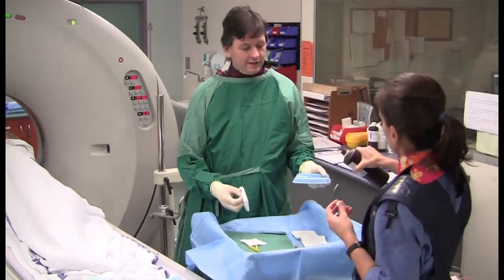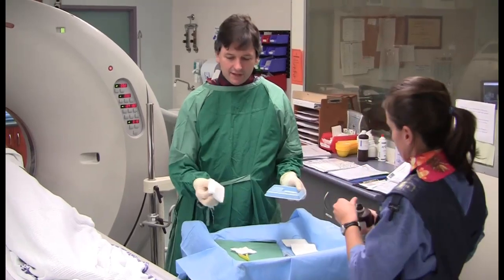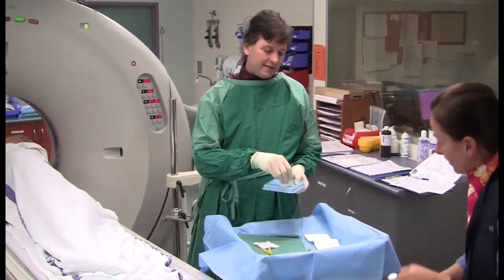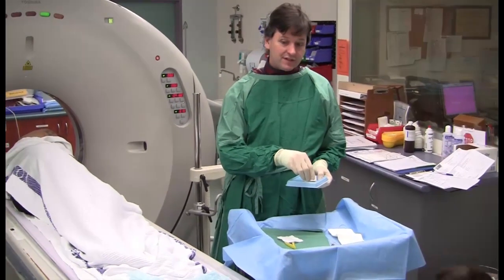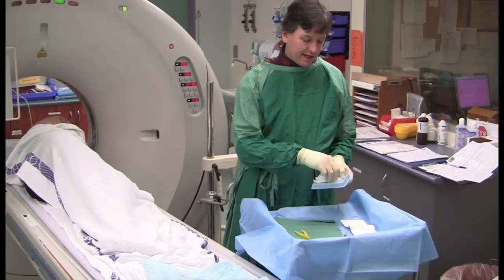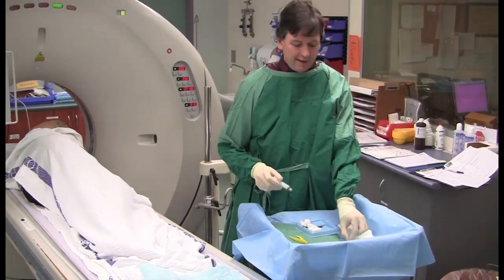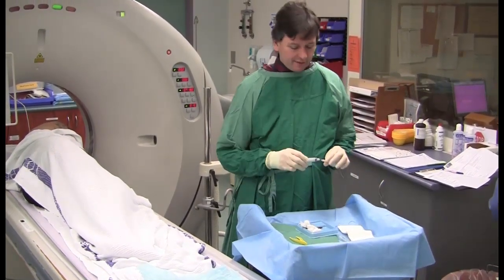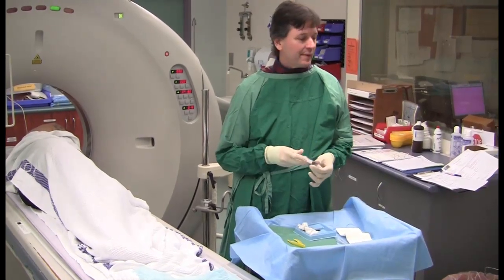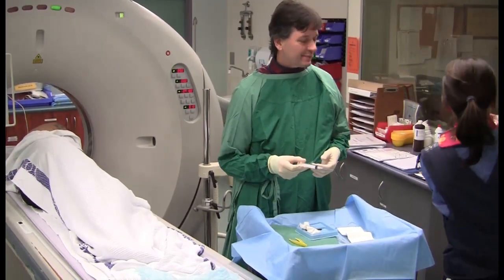What I normally do is take the wrapping off the dressing pack and chuck it across the end of the table here, so it functions as a little sterile handle. I chuck the little tongs that come with the dressing pack onto that to stop them floating off when people walk past. It's only very lightweight plastic.